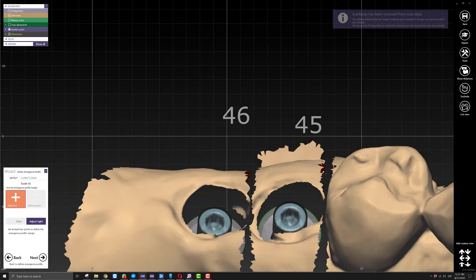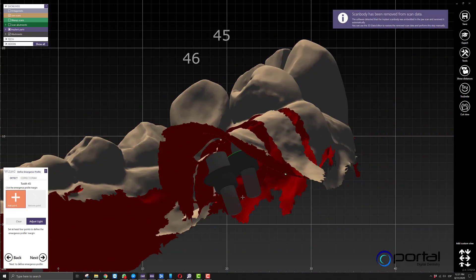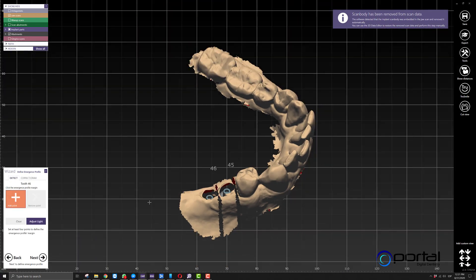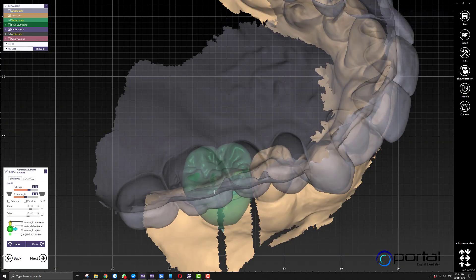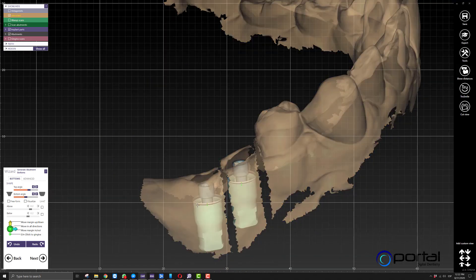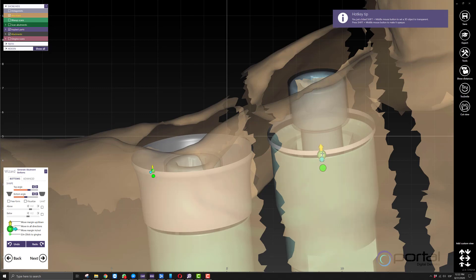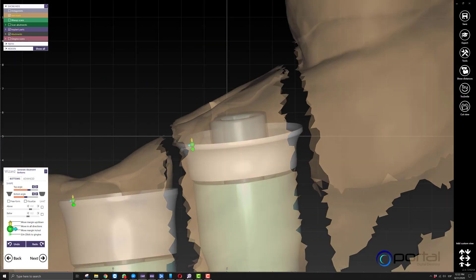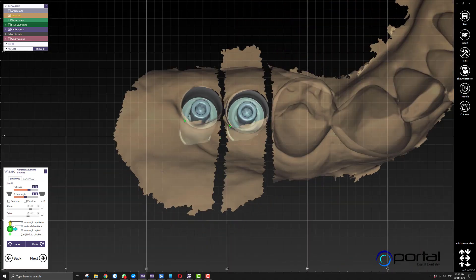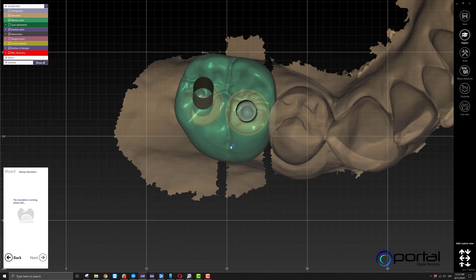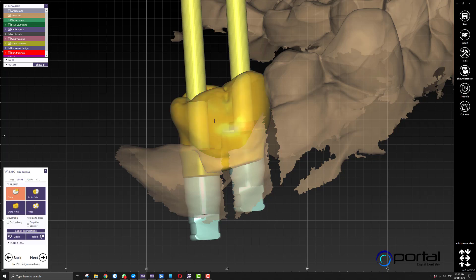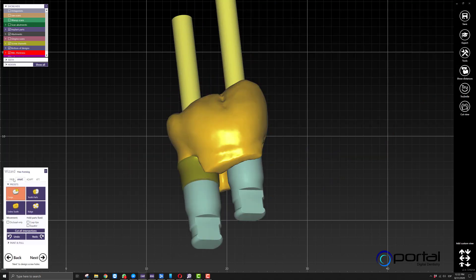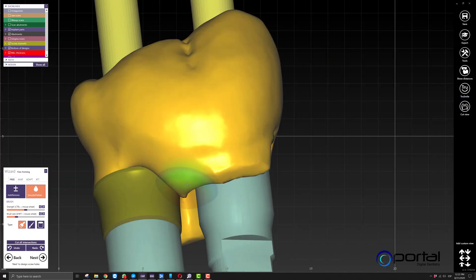We'll go next. Then the software will ask us to do the emergence profile step. I'm going to omit it completely on both. I'm just going to assume you guys know exactly how to manipulate this step. I'll make this small change so the software takes less time to make the adaptation. Once we have our emergence profile design and we're happy with it, we'll click next and the software will automatically start adapting our wax up scan or pontic to the two implants.